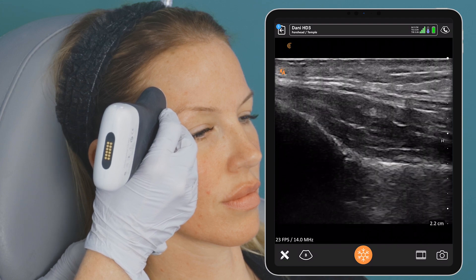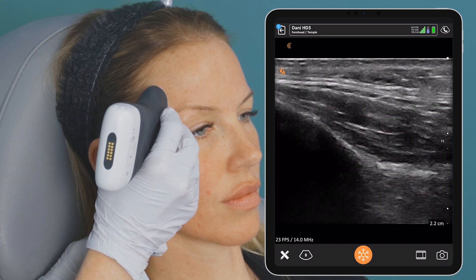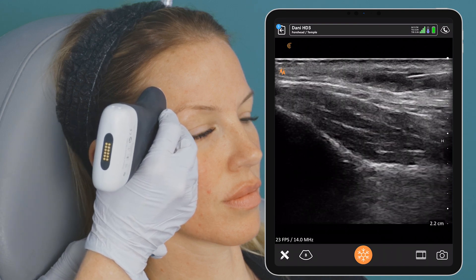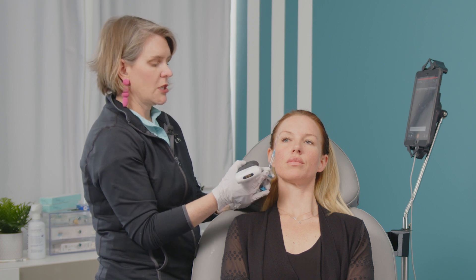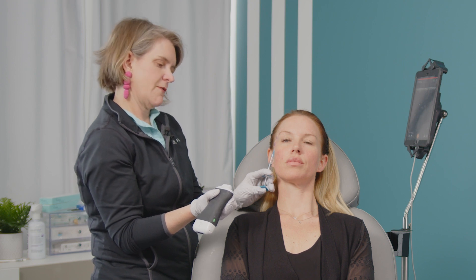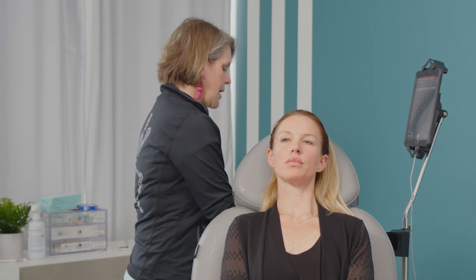We can just lay our bolus. If you want to watch it go live, you can see the anechoic fill, and you can also see on the screen the backtrack of the filler up the cannula. I'm going to get a little better view and just lay my bolus right in that plane. It does spread out fine. Now that I know I'm in that plane, I can take the probe off and watch it fill. That's half a cc of a very low G prime product. I then have her open her jaw again and just spread it out. And that was our first bolus.